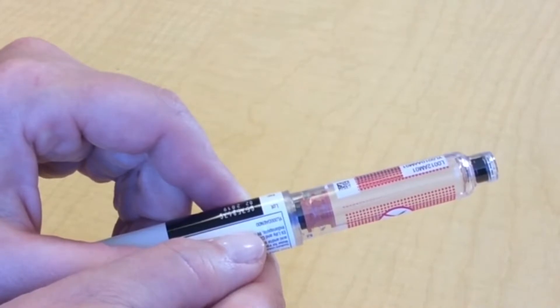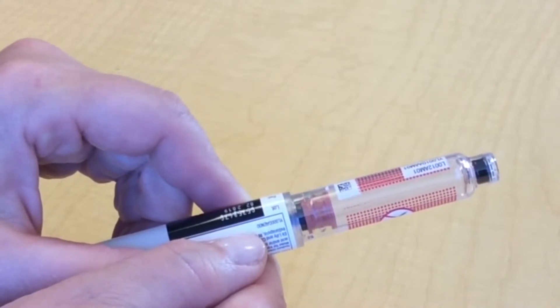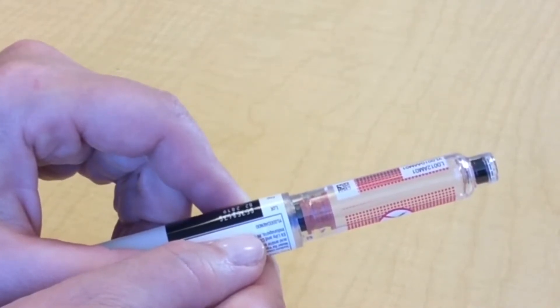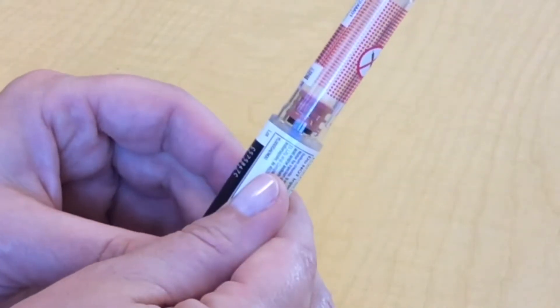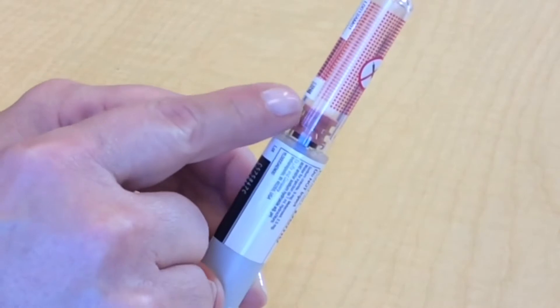Depending on which type of insulin you are prescribed, your insulin should either be clear or cloudy. If your insulin is clear, look for changes in color or for anything solid floating in the insulin.